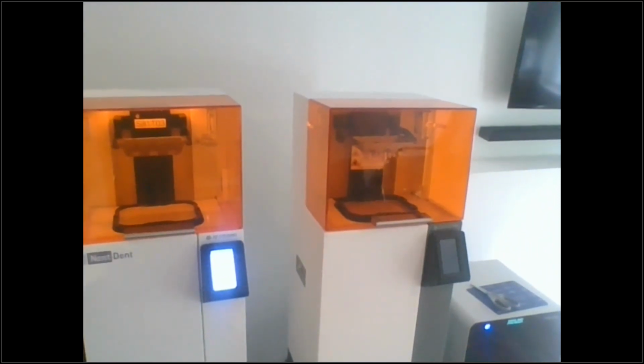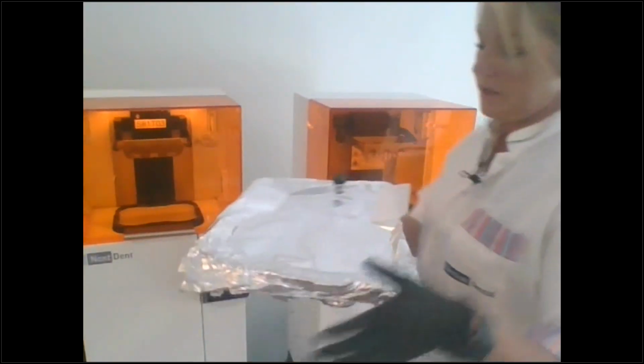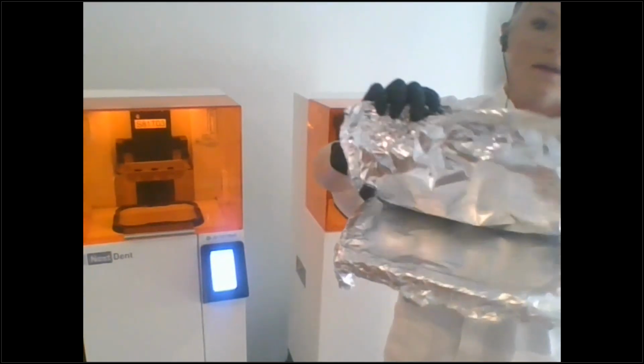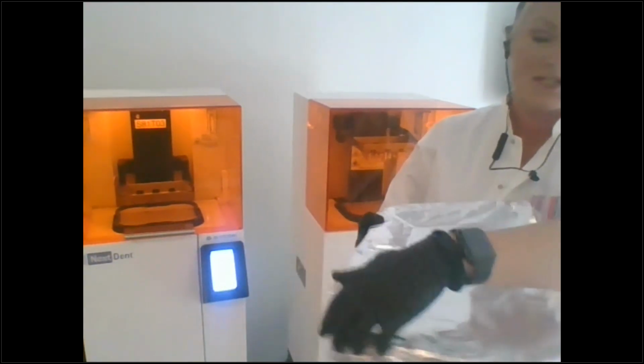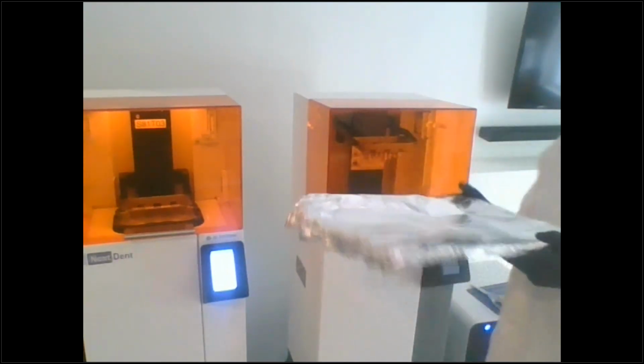Now I'm going to remove the prints that I've done. This is the same build that I showed you how to nest. And I use a cookie sheet with foil, and I showed you guys this on Friday as well. But if you didn't join me, every day I pull off a layer, the dirty layer, and I throw it in the garbage. And on Fridays I put extra layers for next week. So I'm ready to go. It's just faster than cleaning it.